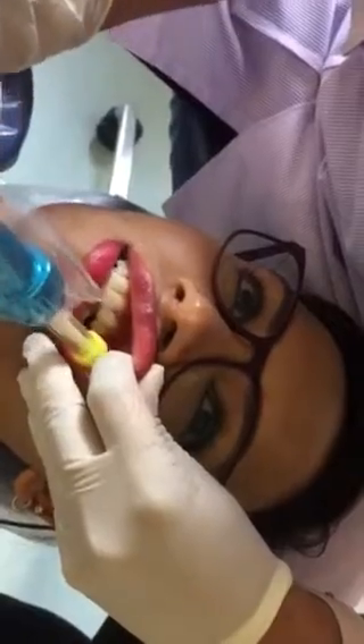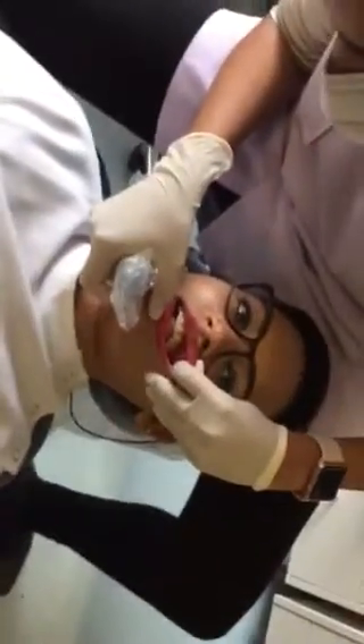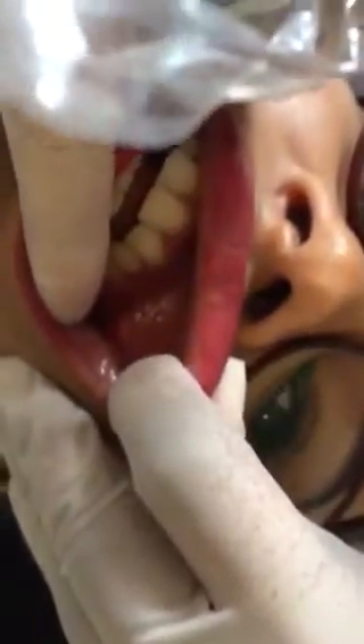Just like a knock on my teeth, but that didn't hurt at all. That's very good. Oh my god, it's working already! Is that what normally happens? Yeah, that's it. You see the red spot there? That's normal. It happened even with an eagle okay — that was amazing!